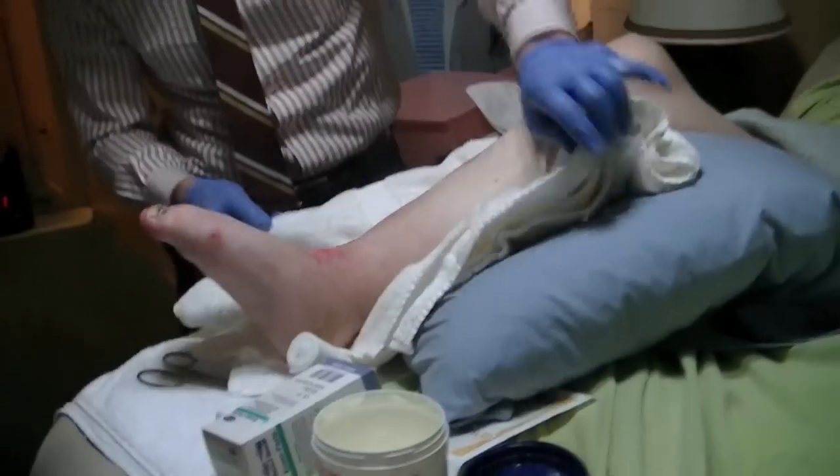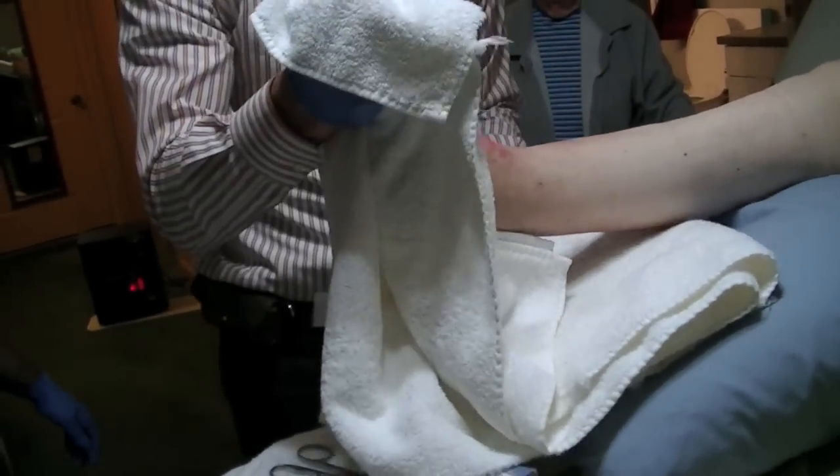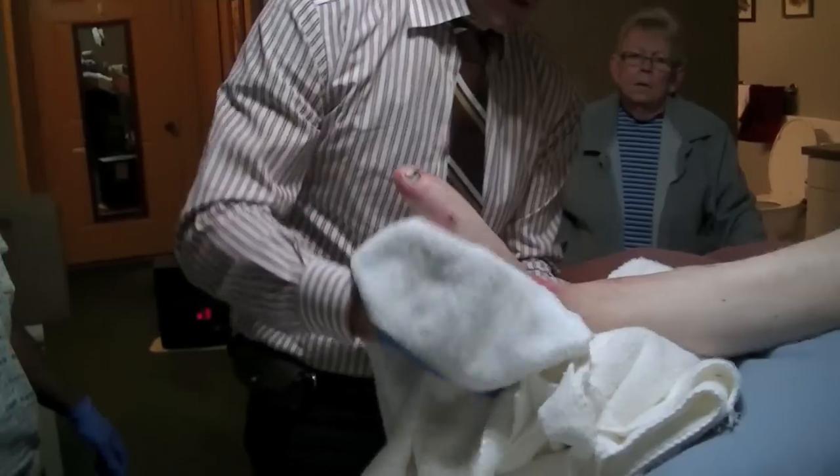You need to dry it because the dressing that we're putting on needs a sticky surface — it needs to have a dry surface.